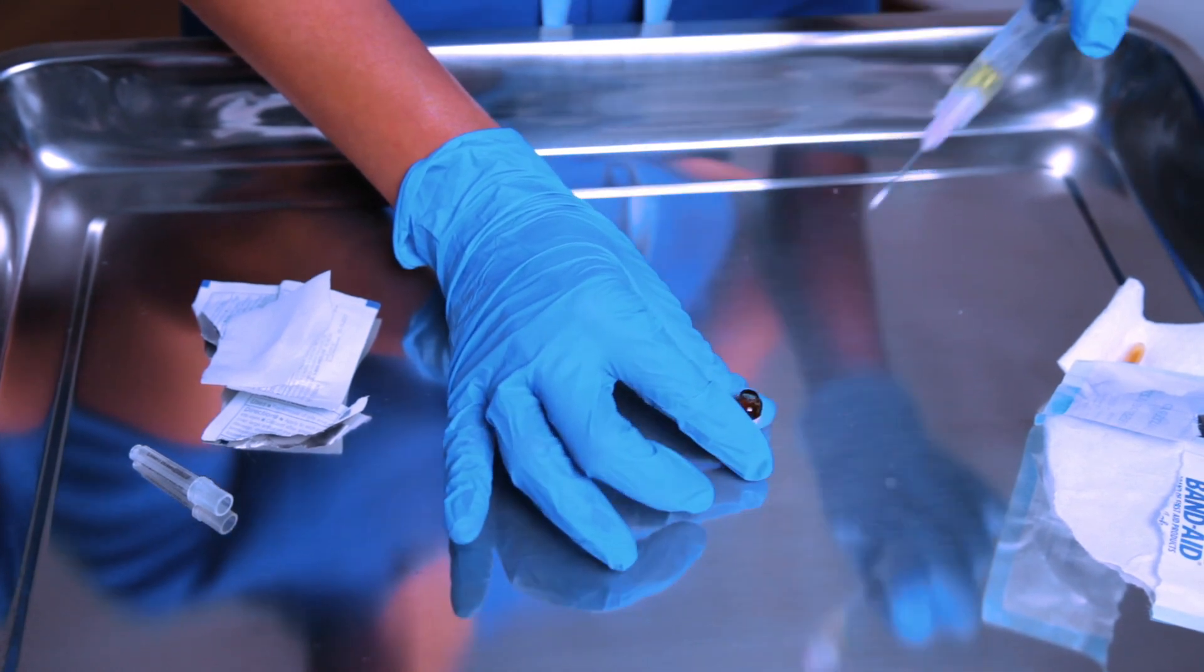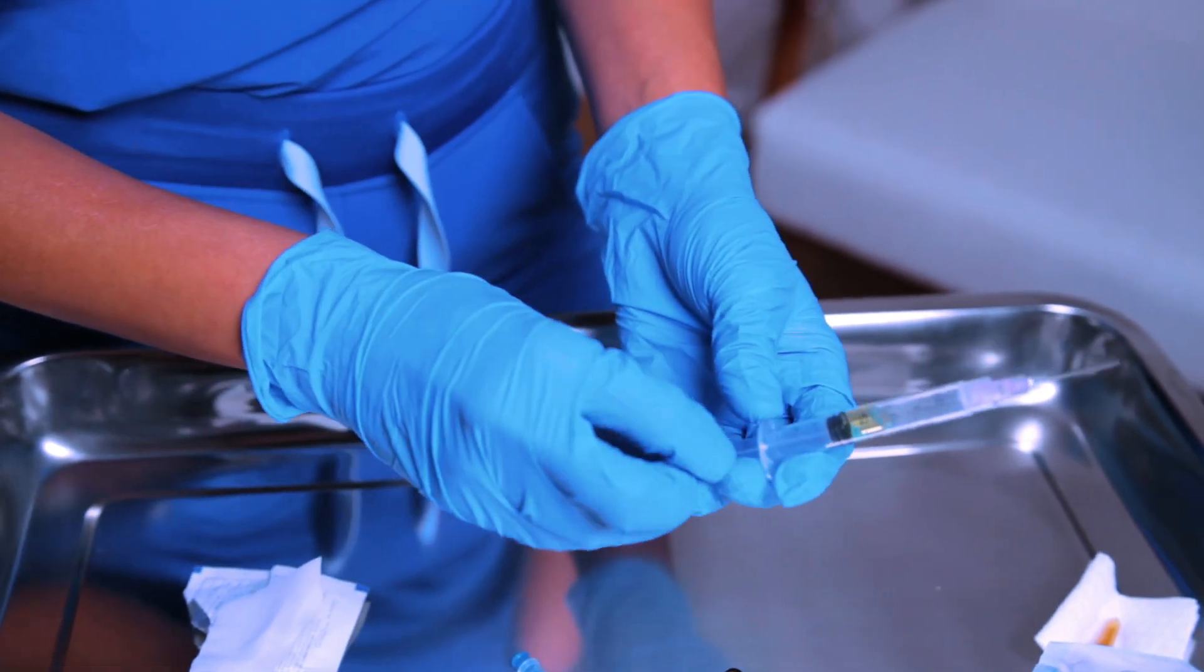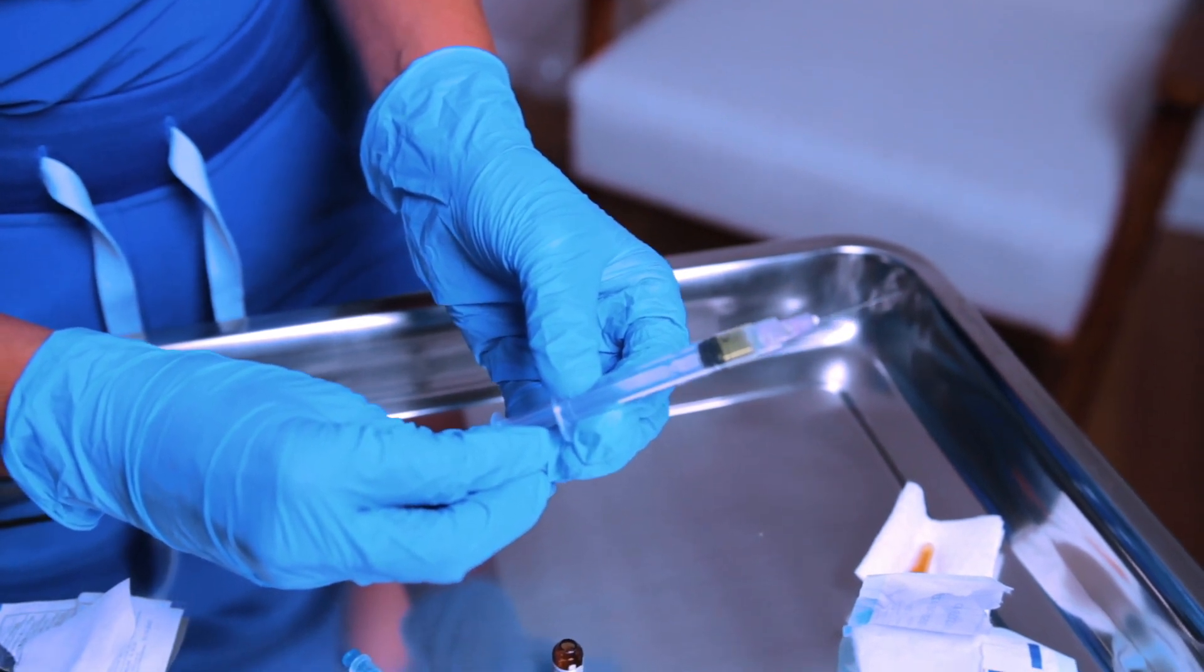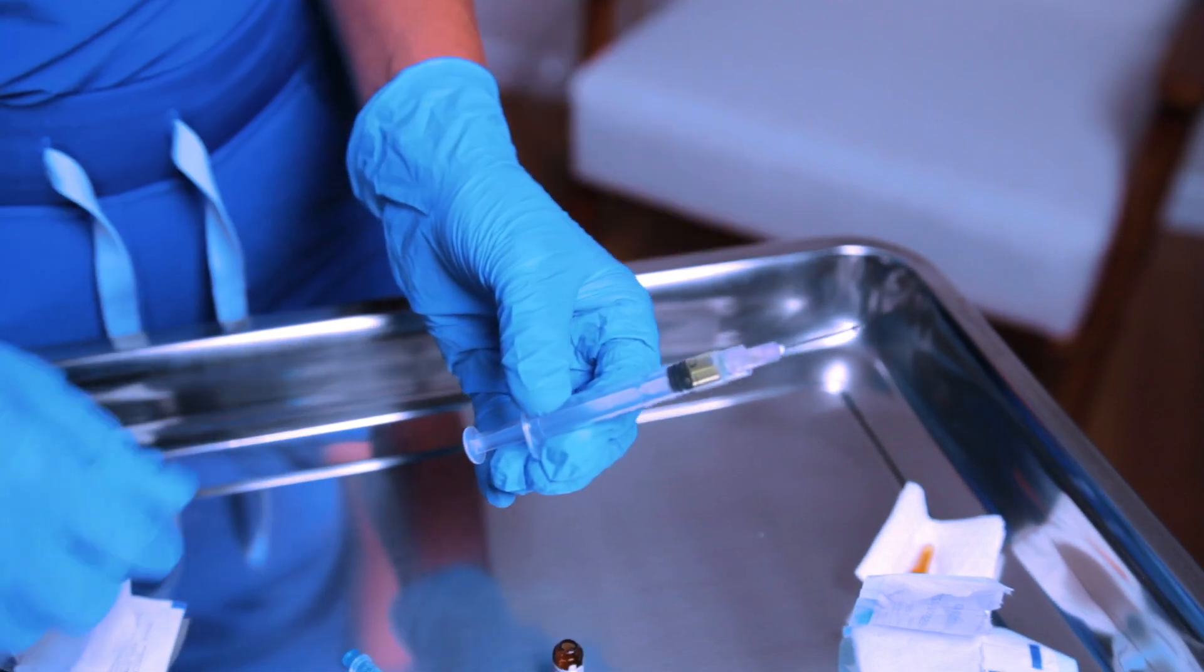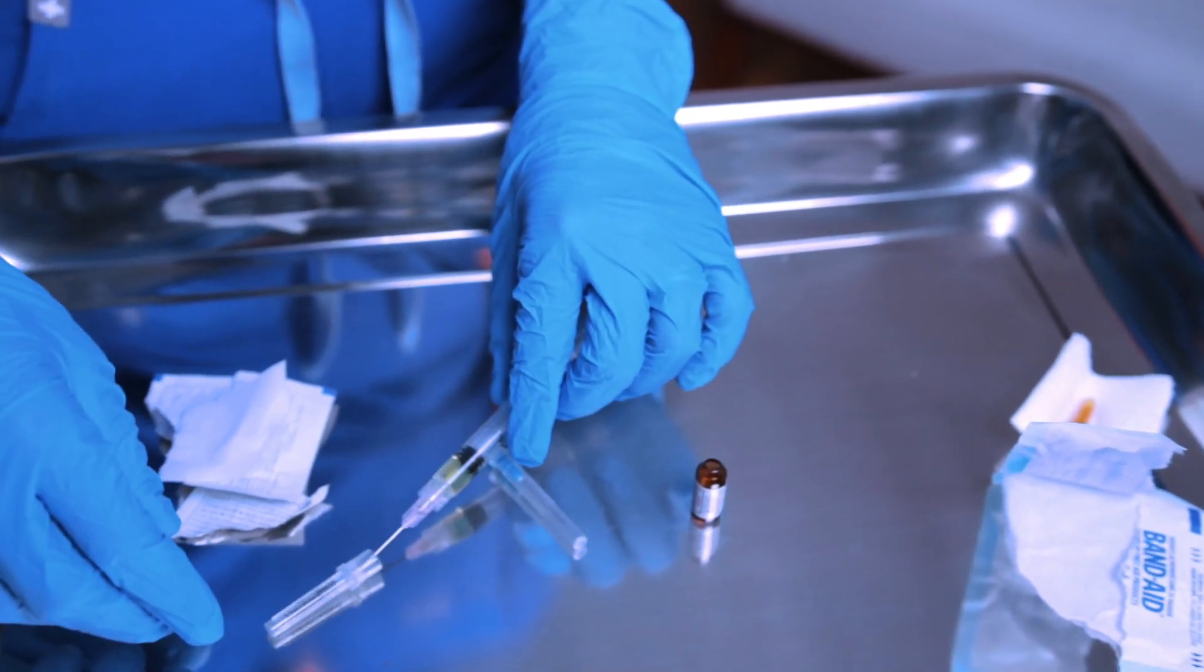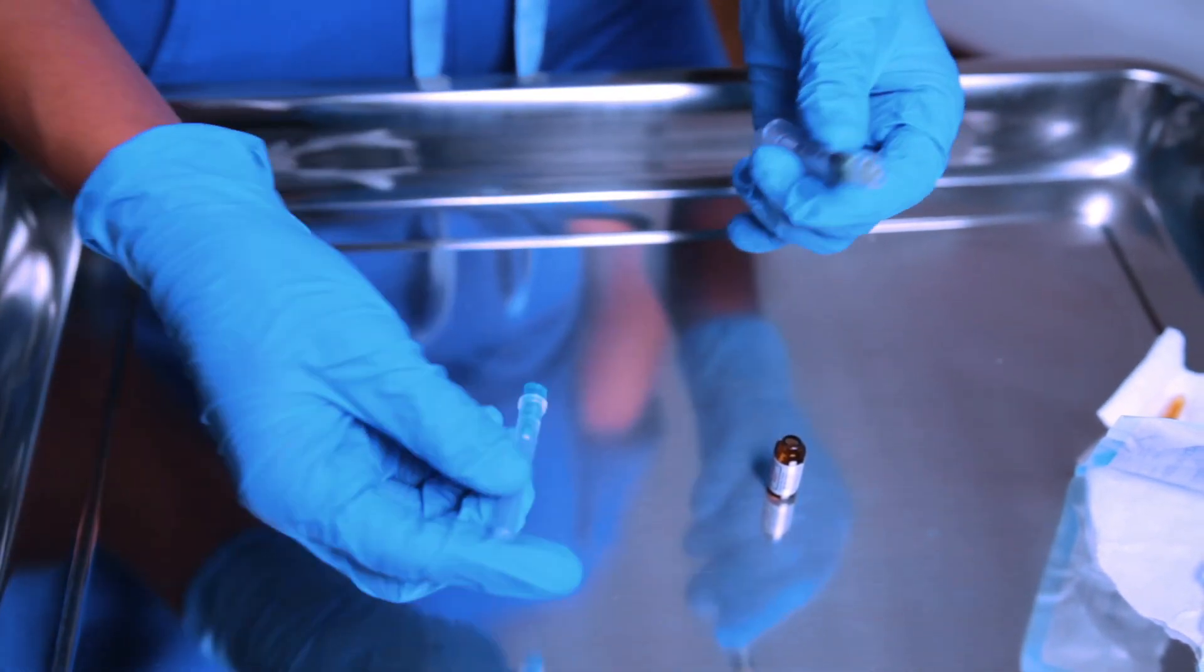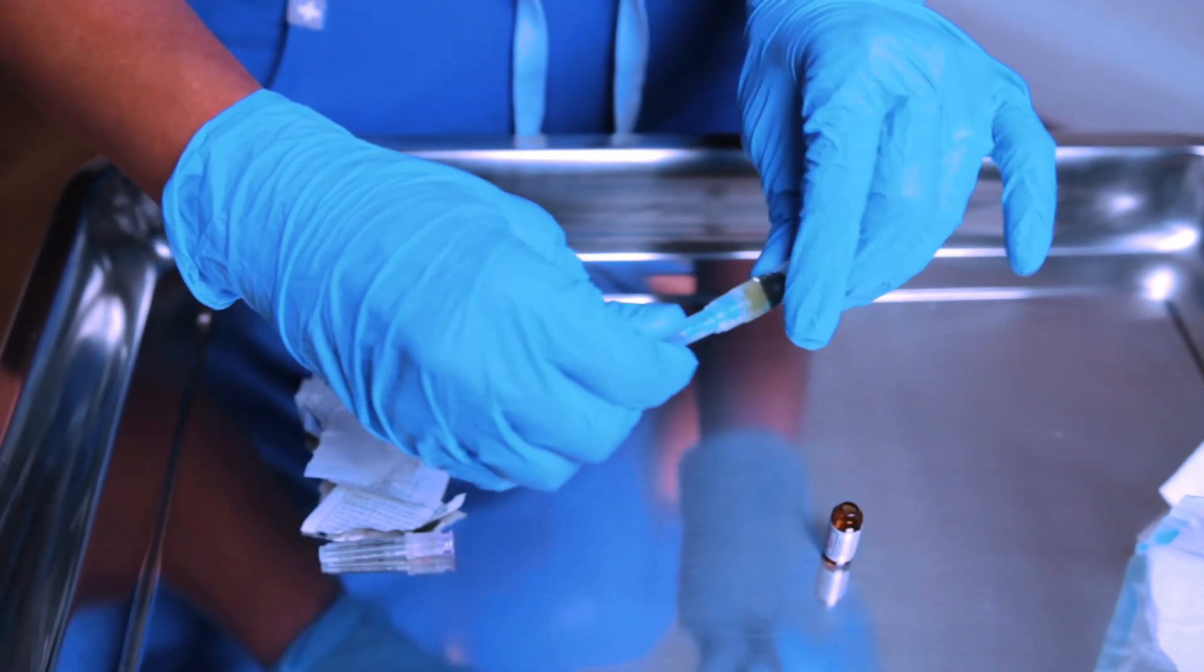So it looks like I have all of the contents. I'm going to remove my needle, I'm going to bring the syringe upside down, and then I'm going to get the air out. So I'm going to push the plunger of the syringe up until I see it's collected in the hub and it kind of peeks out on the top. Now I'm going to recap this with one hand. And then once it's recapped, I'm going to disconnect and I'm going to put my needle that I will be administering to the patient.